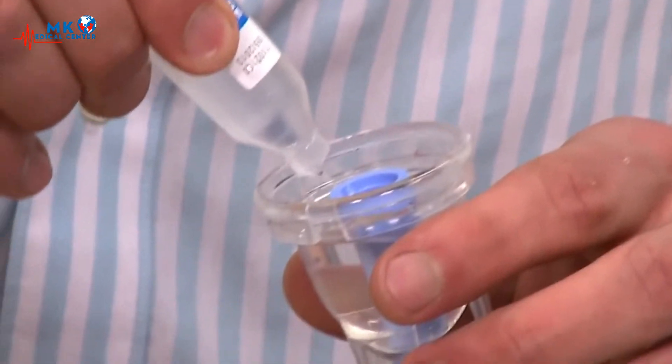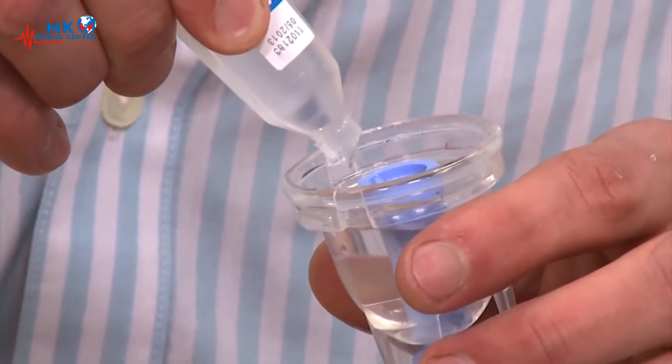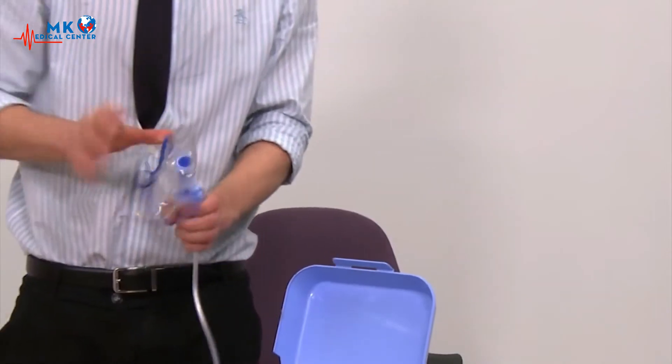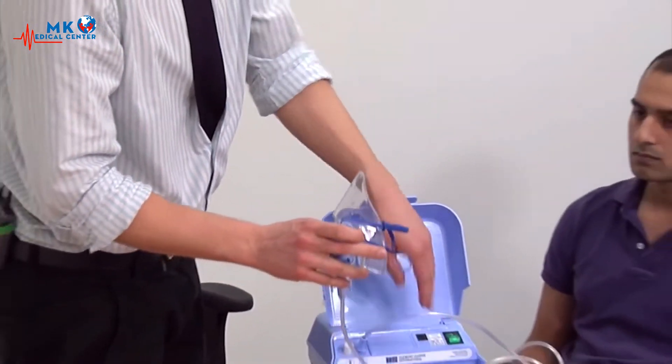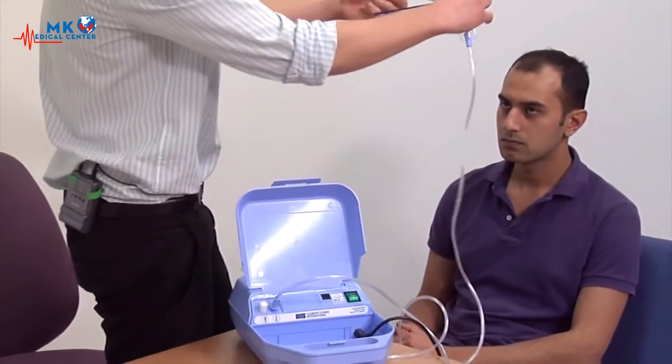Drugs such as salbutamol are also added in this way. Turn on the nebuliser and secure the mask in place. A good fit is essential to ensure that vapour does not irritate the patient's eyes.